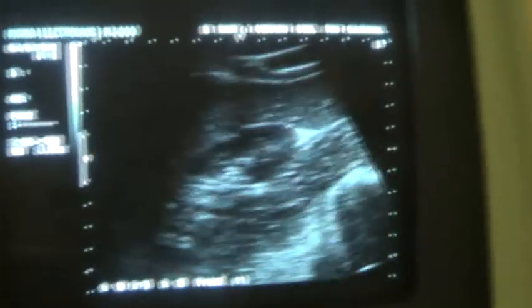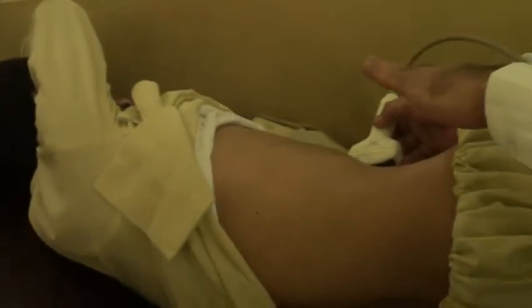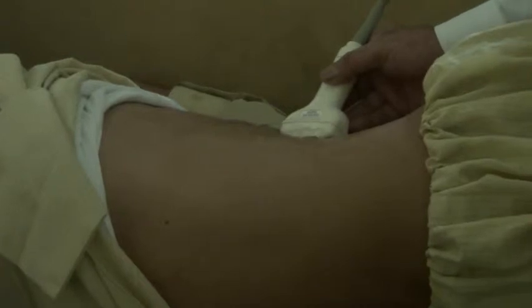Now let's see that we can get the kidney from the subcostal region. Now turn the patient in the left lateral decubitus posture. Place the probe in the subcostal region. Here, this is the lower end of the subcostal region of the patient. And then angle the probe cephalad in this fashion and move the probe downwards or upwards if you require, and ask the patient to take a deep breath and hold it if required.